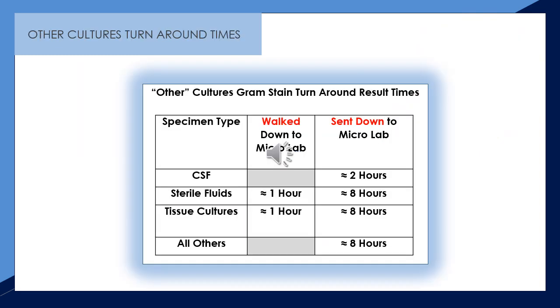Other cultures turnaround times. This slide is provided as a reference for other cultures' gram stain turnaround result times.